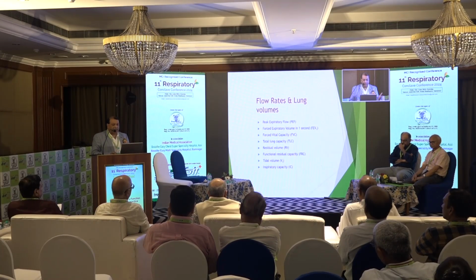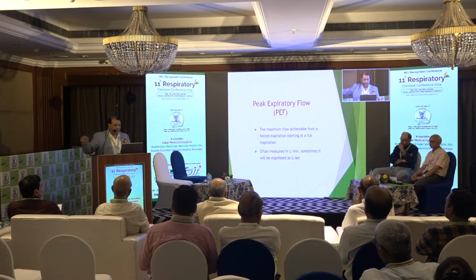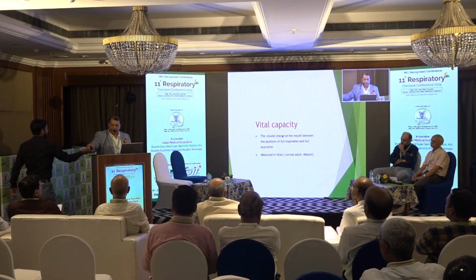Generally there are various lung volume measurements: peak flow, forced spirometry, maximum flow rate, peak value, and tidal volume, the vital capacity of the lungs, and forced vital capacity, and forced expiratory volume in 1 second. Residual volume is measured in restrictive lung patterns, where FRC values are also measured, along with total lung capacity.